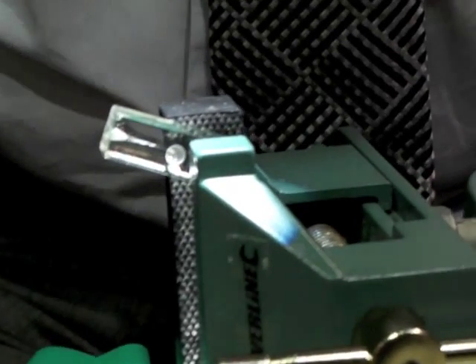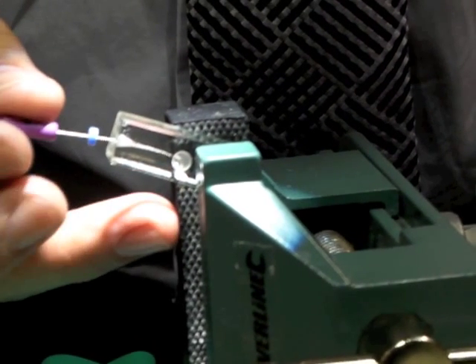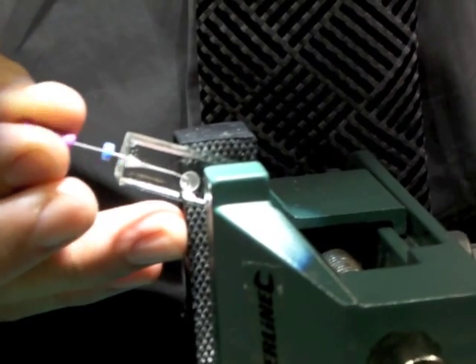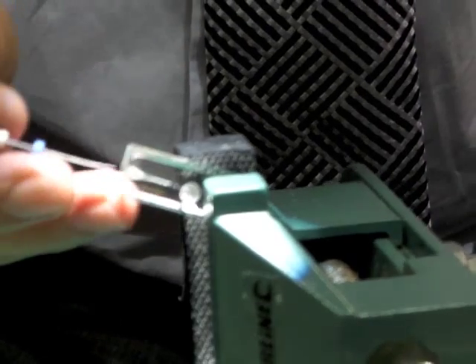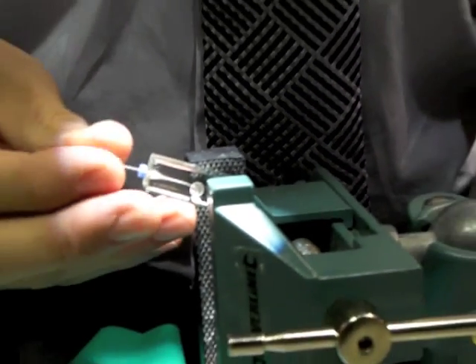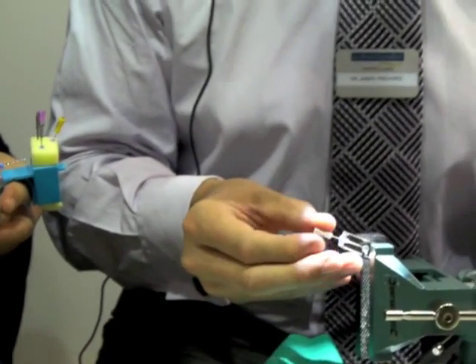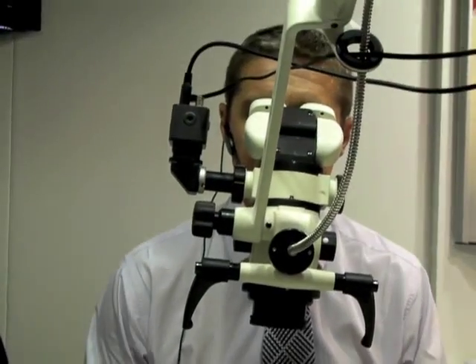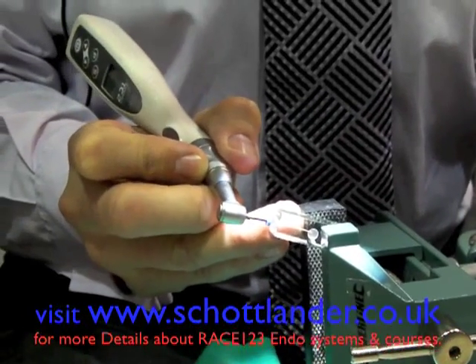We then use a size 10 hand file to do our working length measurement with an apex locator, and then use the size 10 hand file to instrument the canal until the file is loose. We then repeat that with a size 15 hand file until the file is loose in the canal. Once the size 15 file is loose in the canal, we can go back to our T1 instrument and use it to instrument the entire length of the root canal.